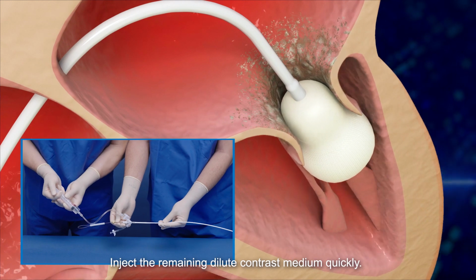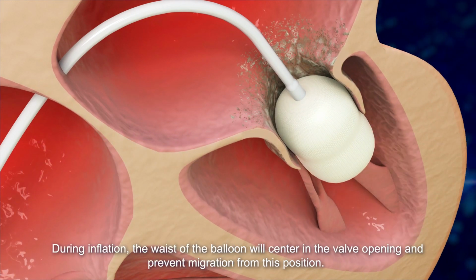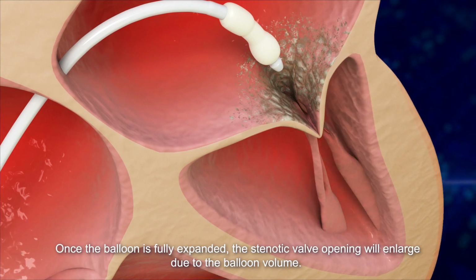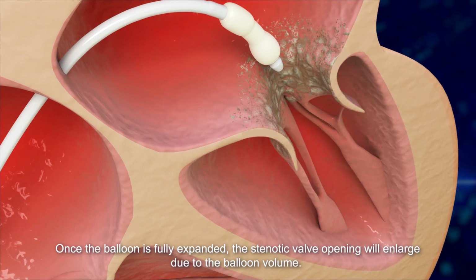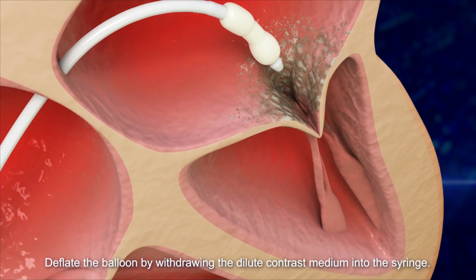Inject the remaining dilute contrast medium quickly. During inflation, the waist of the balloon will center in the valve opening and prevent migration from this position. Once the balloon is fully expanded, the stenotic valve opening will enlarge due to the balloon volume. Deflate the balloon by withdrawing the dilute contrast medium into the syringe.